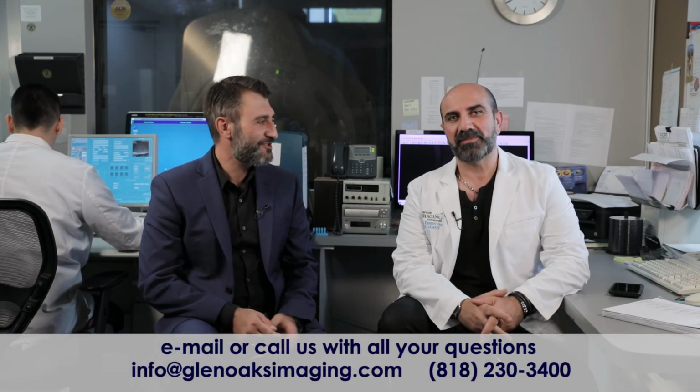Well, we hope it was as visual and as fun as we promised. And hopefully next time when you see an image of an abdomen, you will know if it's an X-ray, MRI, CT, or an ultrasound. Or just in general, what an MRI looks like.